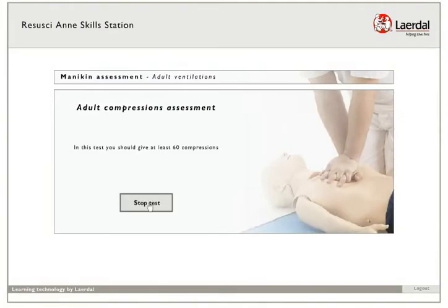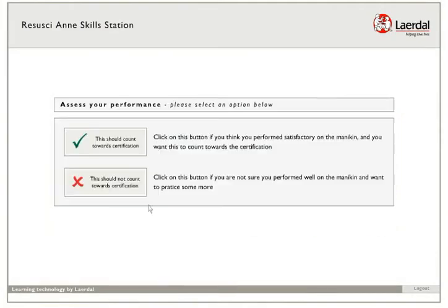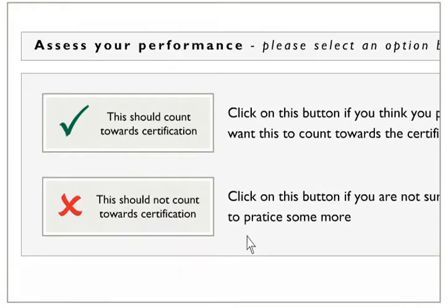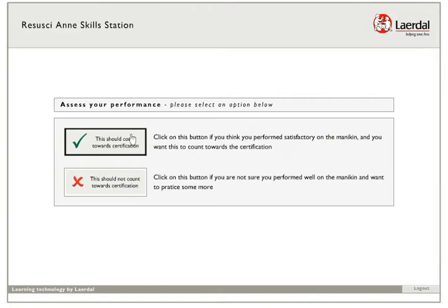After pressing stop, you are asked to evaluate your own performance. If you feel that your performance was not as good as you would want it to be, please select 'This should not count towards certification' and no data from your practice will be saved in the system. If you are confident that your performance was good, select 'This should count towards certification.'